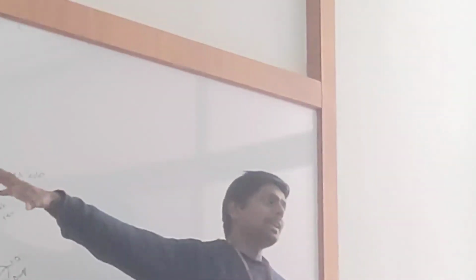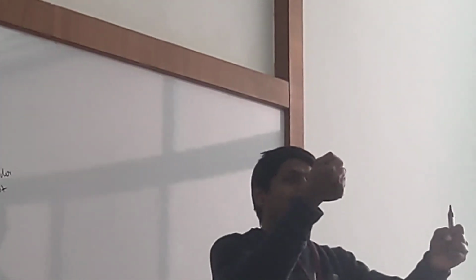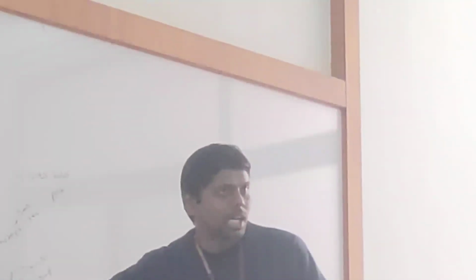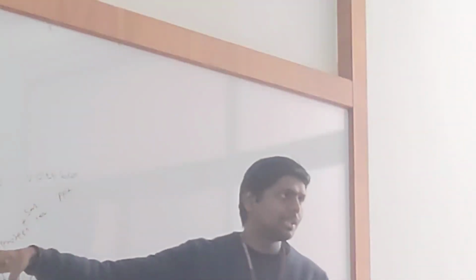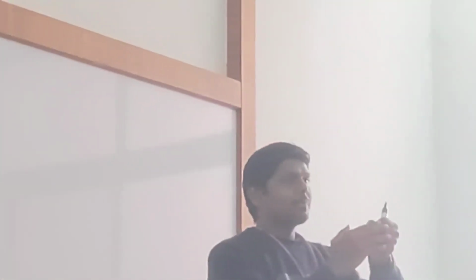So first I got the iron value, then I saturated whatever protein is available in the blood sample. To that protein I added an excessive amount of iron molecules to completely saturate it. How many iron molecules can this protein take? That is the total iron binding capacity of this protein molecule.